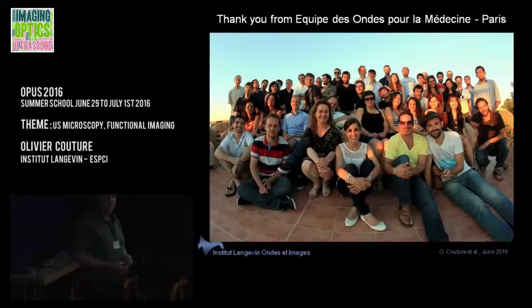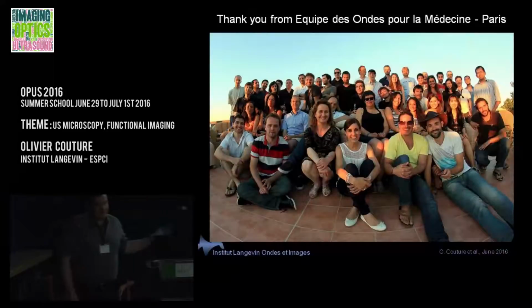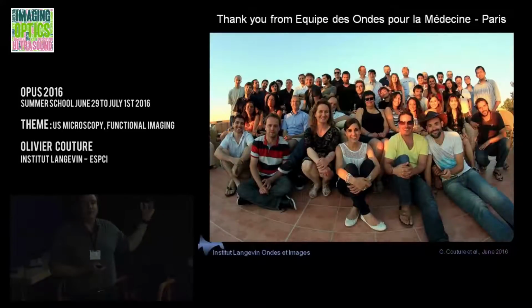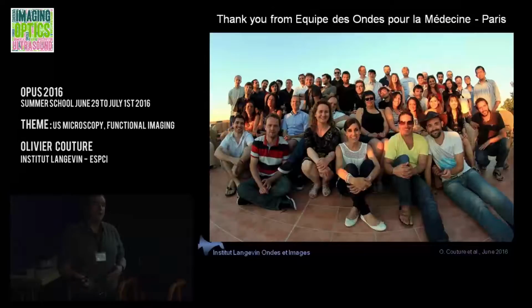Would it help to use smaller bubbles, or do you lose too much signal then? Well, yeah, there's a compromise there, because since we're not using bubbles that are resonant, here we just need bubbles that are very echogenic and big enough. If we use smaller bubbles, we will have less signal, and we will have the same problems that you saw with the skull: lower SNR, fewer bubbles, you cannot reconstruct the whole thing. This is also something that we're trying to work on, because obviously if you're using smaller bubbles, you can access not necessarily vessels, but structures outside of vessels that currently we cannot do with purely vascular bubbles.